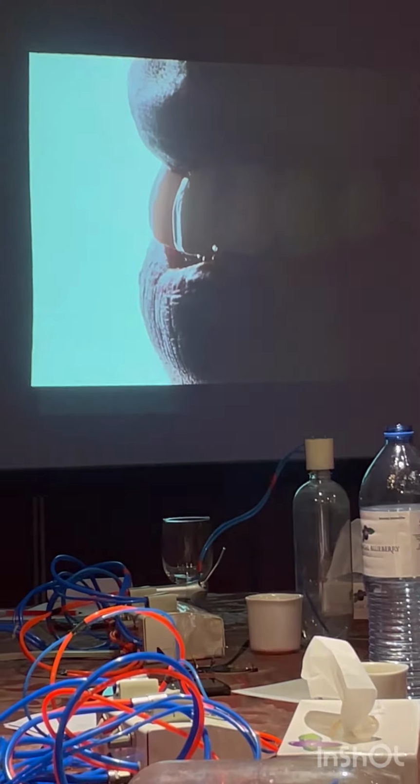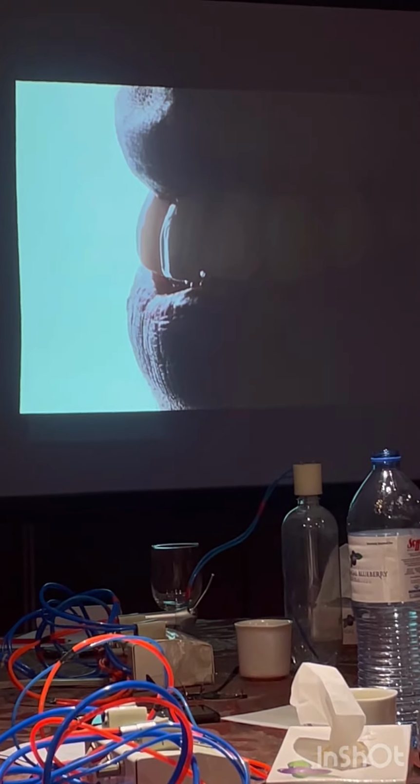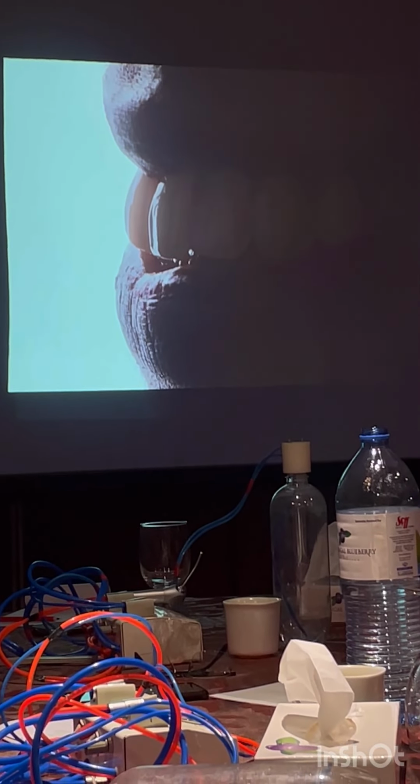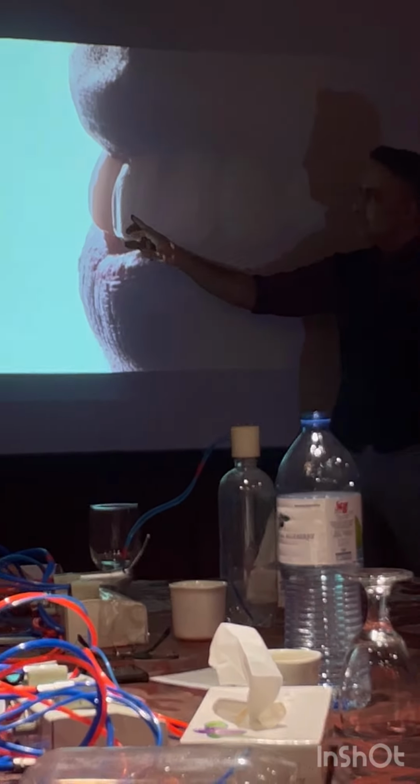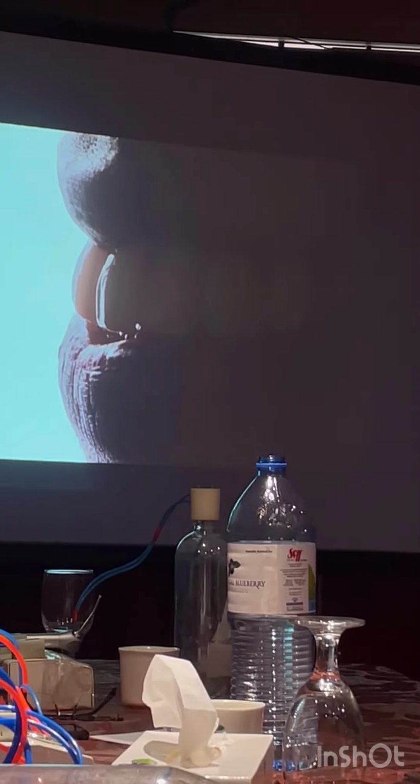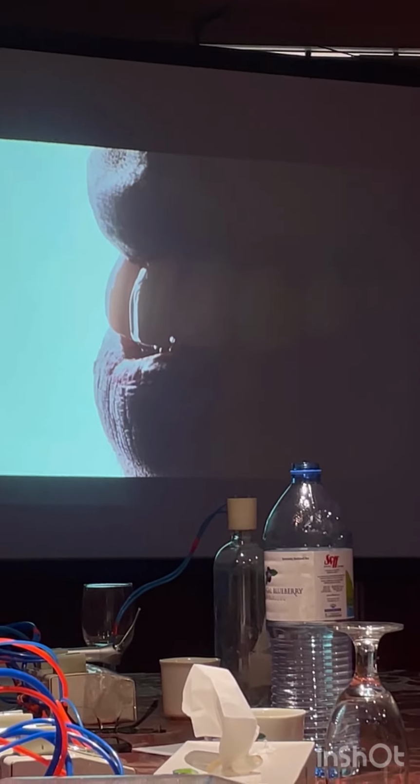See here, when I cross-polarize it, this is called cross-polarization. Take a picture from your iPhone or smartphone, Android, reduce the contrast and brightness. You reduce the light. Can you see the textures? Beautiful. And this is exactly what you need to give. So every patient has these kinds of textures.